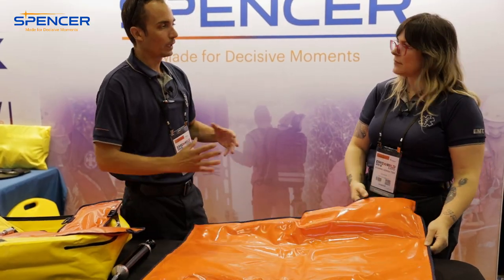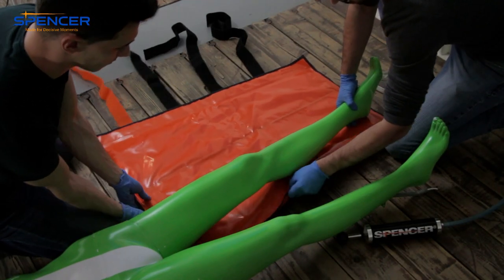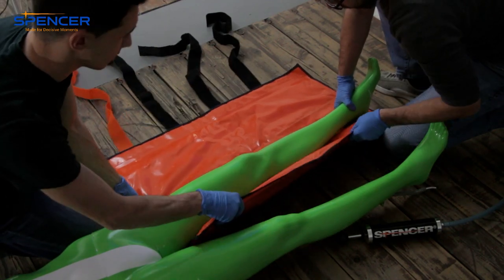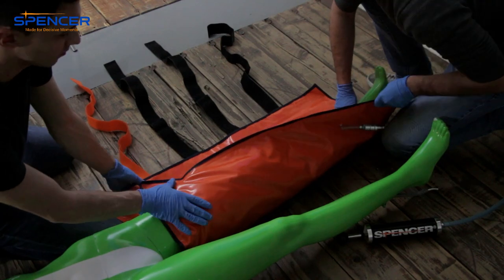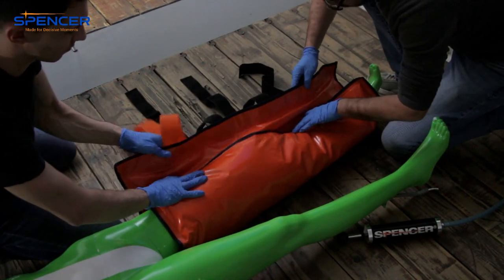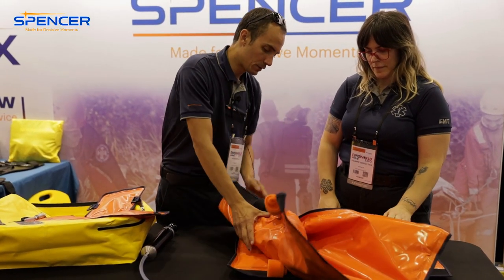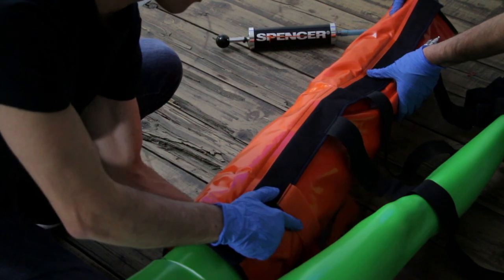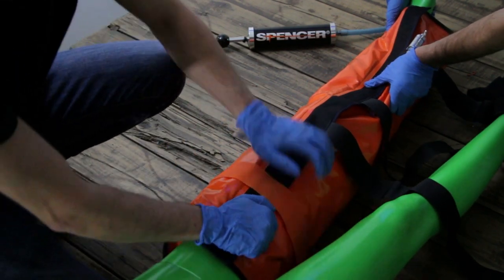The more hands you have when applying this, the better it works, so having a couple of providers on scene helps. You're going to wrap it over the top, and then as you pull out the air it becomes more rigid — that's the word — rigid.